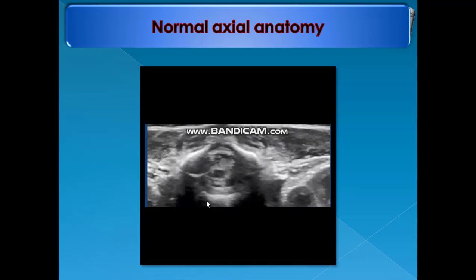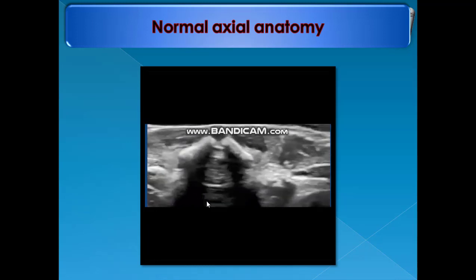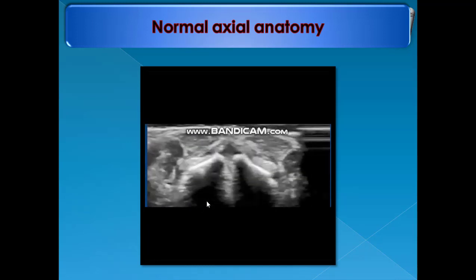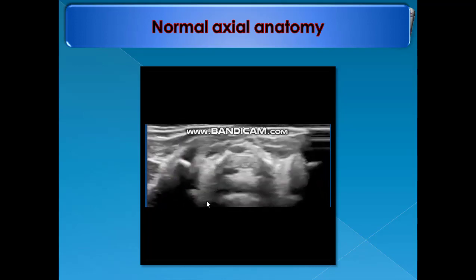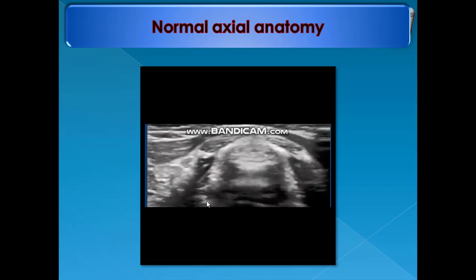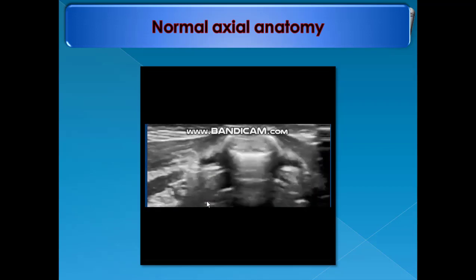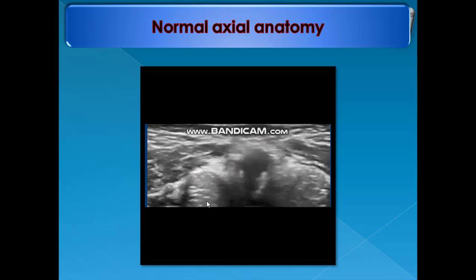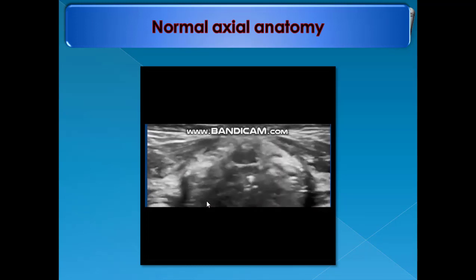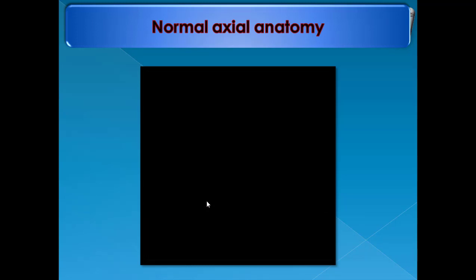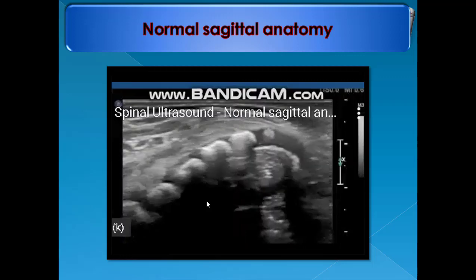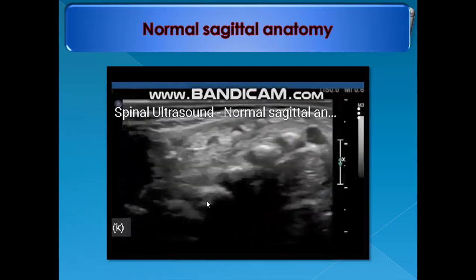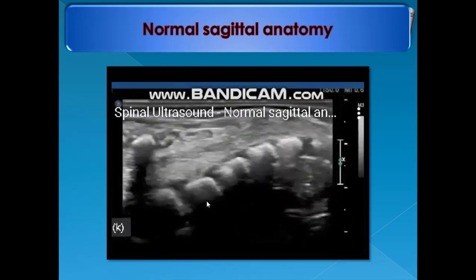This is an example of normal axial anatomy by survey, starting from the mid-thoracic region and moving downwards to the sacrococcygeal region — a rapid technique just for the survey. This is another example of the sagittal survey technique, sweeping from one side to the other.